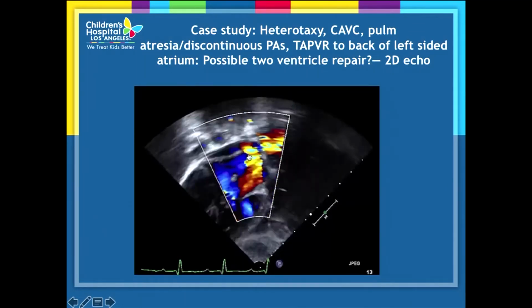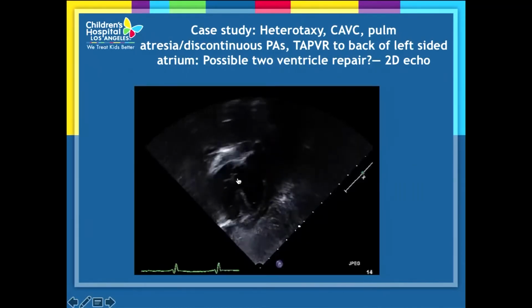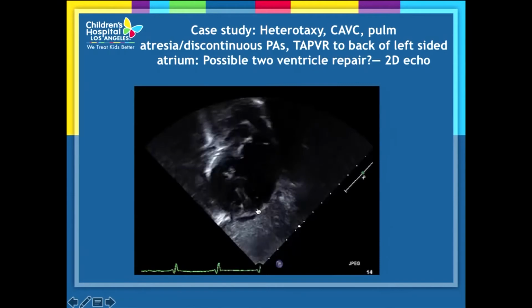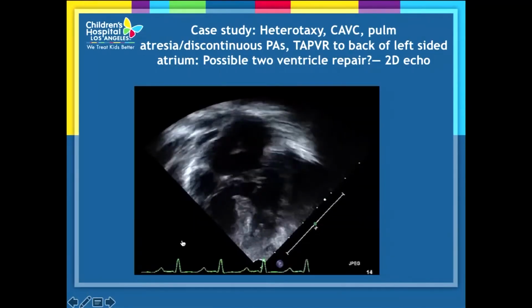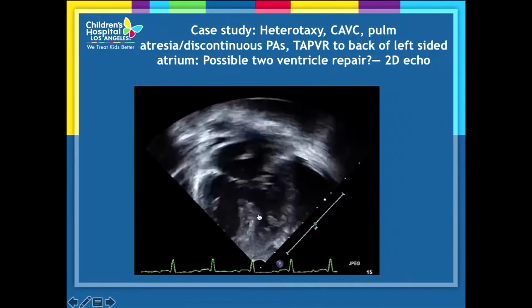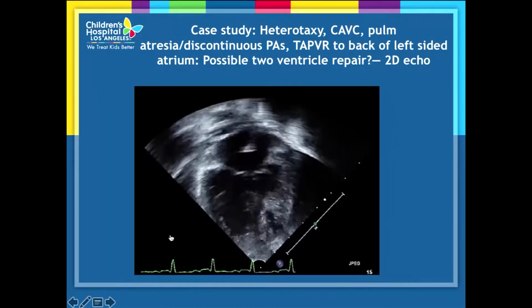And you can kind of see it here. This is actually IVC flow coming in. There's pulmonary veins coming in over here. And you can kind of see over here that with 2D imaging, there's a little bit of imbalance of the AV canal, but it's hard to tell for sure. And then this is just sort of showing it. However, when we look at the apical 4-chamber view here, there was a question about whether this patient might actually be septatable. And this is a real question, although we know that heterotaxy patients are usually not septatable. This is one, especially asplenia.